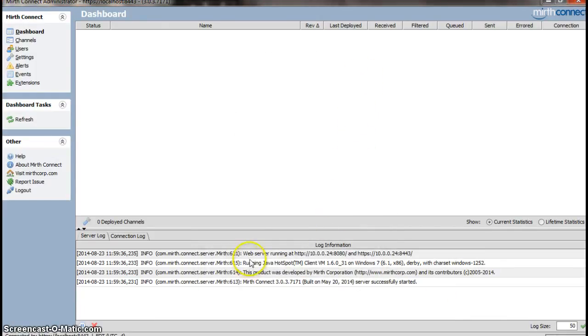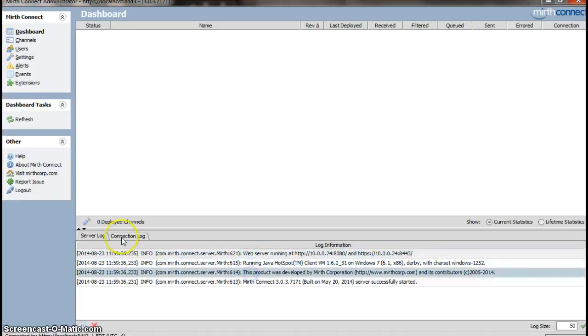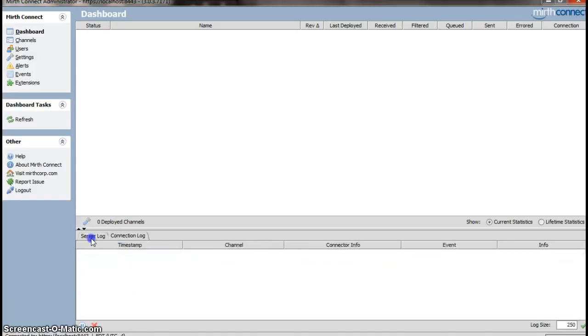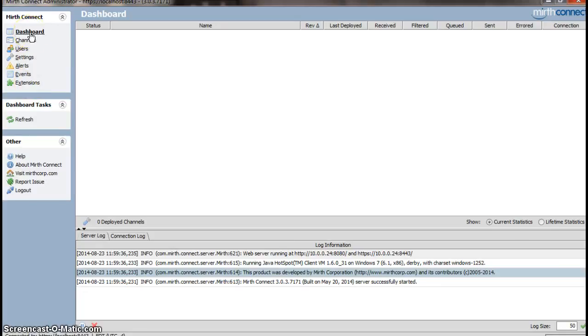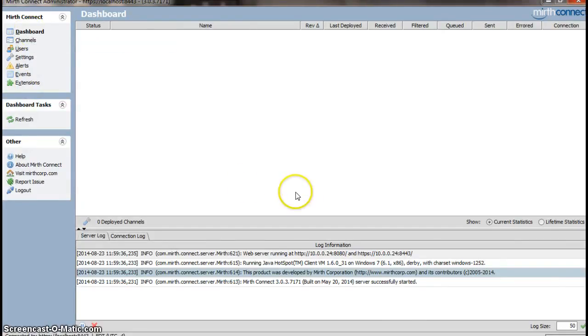And it's installed, and you can see it's running. You get messages here. Connect your log. Here are your channels. Well, I'll have another tutorial on how to create a channel and how to actually take a message and flow it through Mirth completely. But for now, I just wanted to show you the installation. And that should be it.